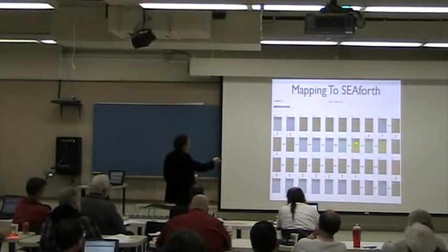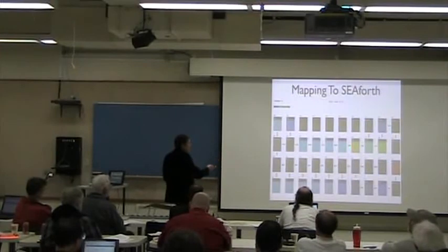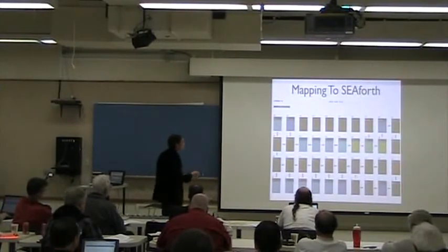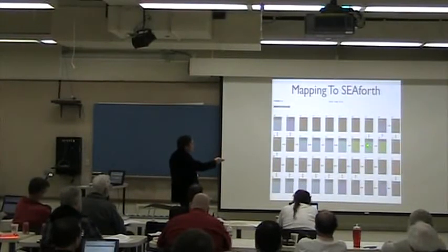This is why it's pretty busy, because we calculate the logarithm for every band, so it's kind of multiplexing the calculation. And this is the exponent, and of course the exponent is supposed to be fit with the parameters.